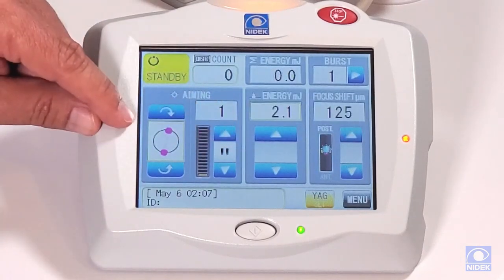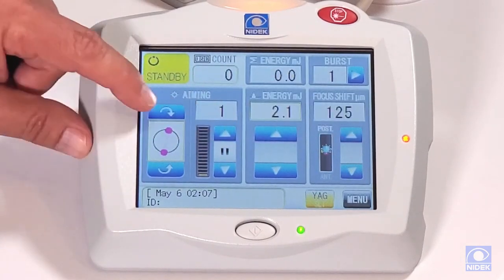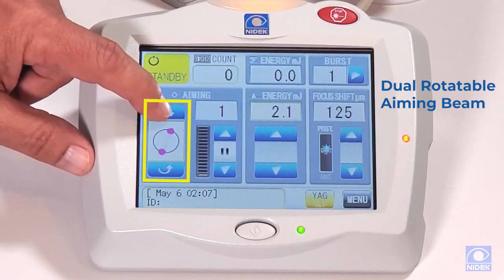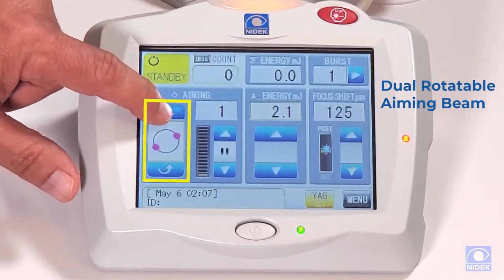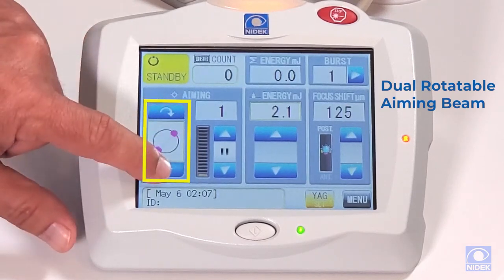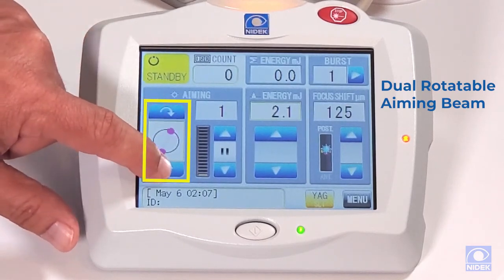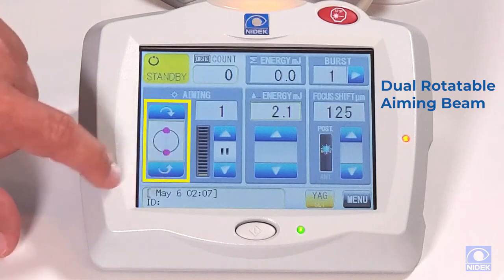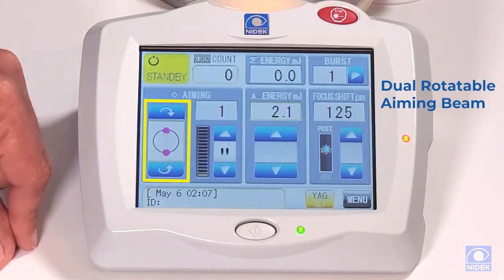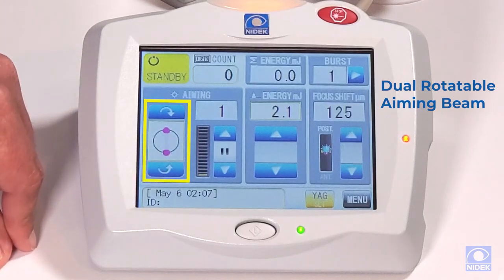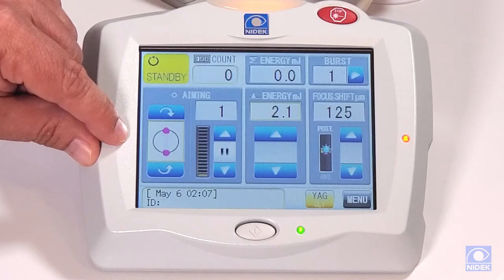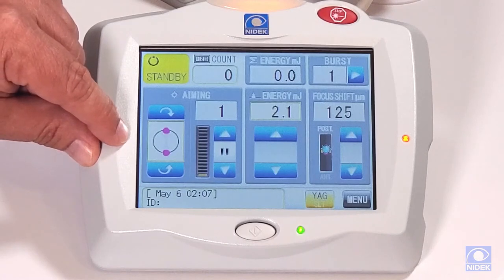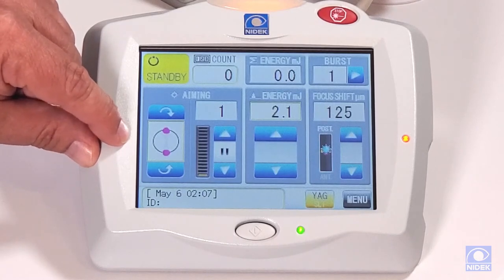Over here on the bottom left, this is our rotating aiming beam — our dual aiming beam. We can rotate it left or right 360 degrees. This is in addition to our motorized rotating angle that we can activate on the S switch utility behind the joystick.